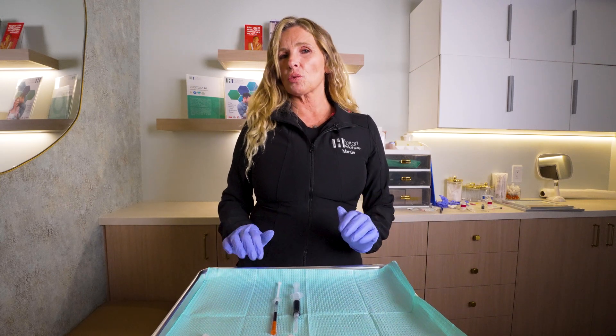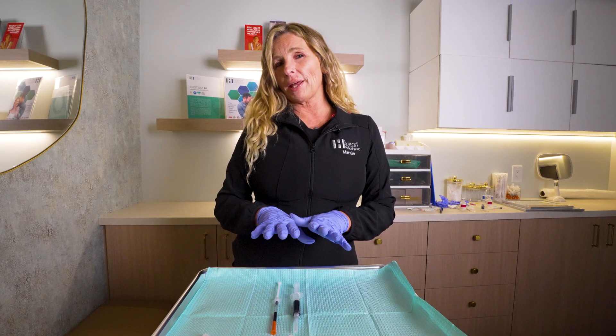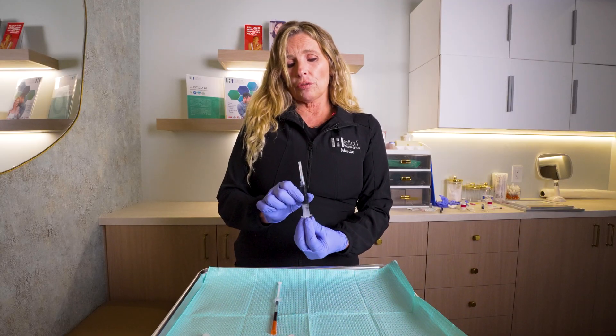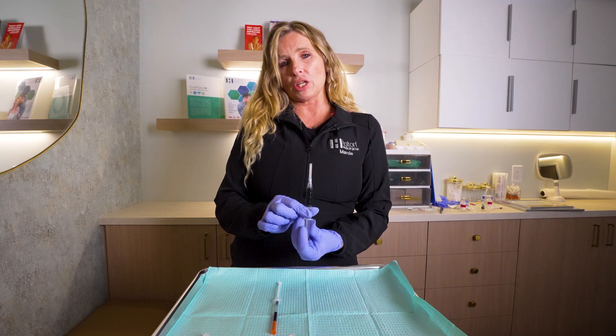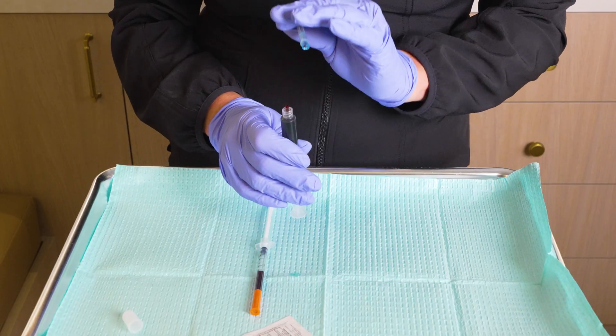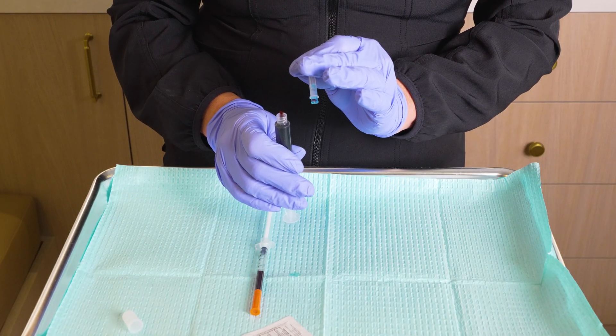Hi, you've received your B12 injection. We're going to go ahead and show you how to give that to yourself today. You should have received your injections fully ready to go. The only part you'll need to do is affix the needle that's come with your syringes.